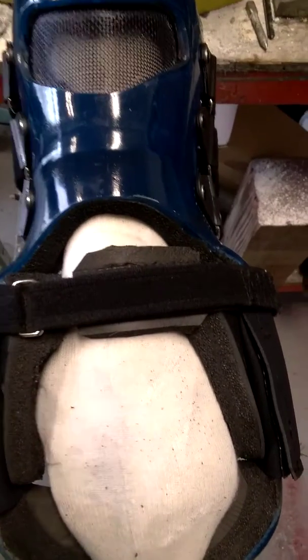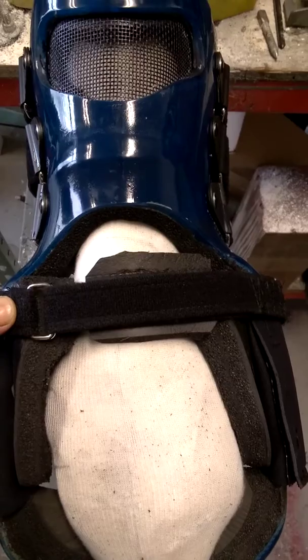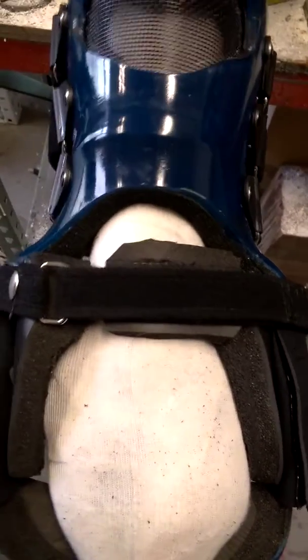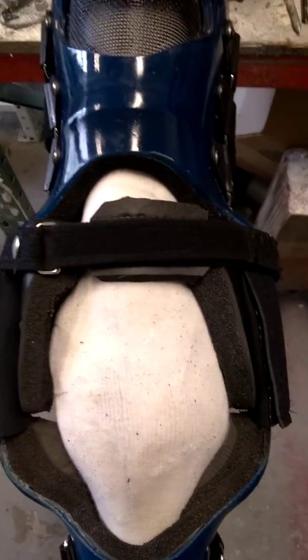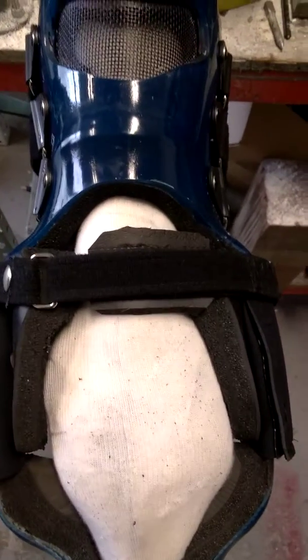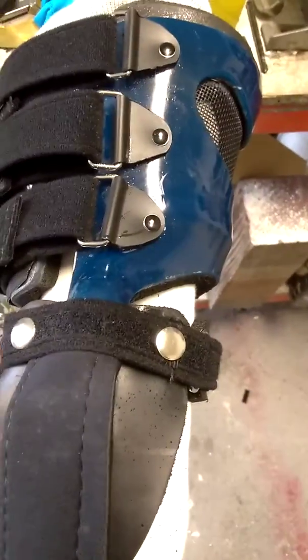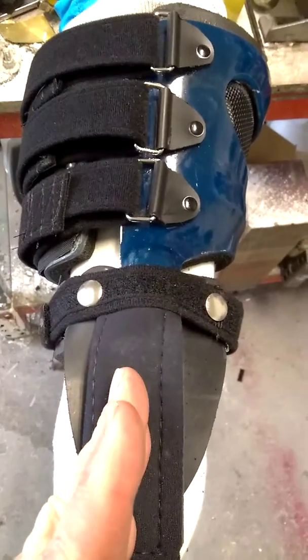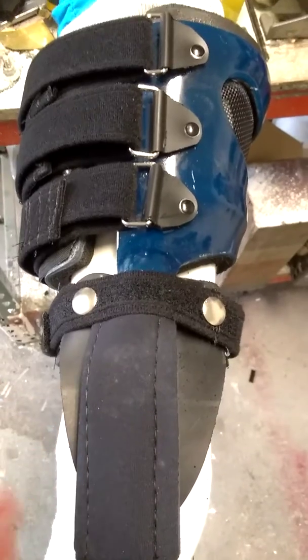We also have migration straps, which assist with containing this suspensory system front and back. The beauty of these straps is they provide support and migration control, and by tightening or loosening the front or the back strap, you can actually position the hinge forward or back if need be.